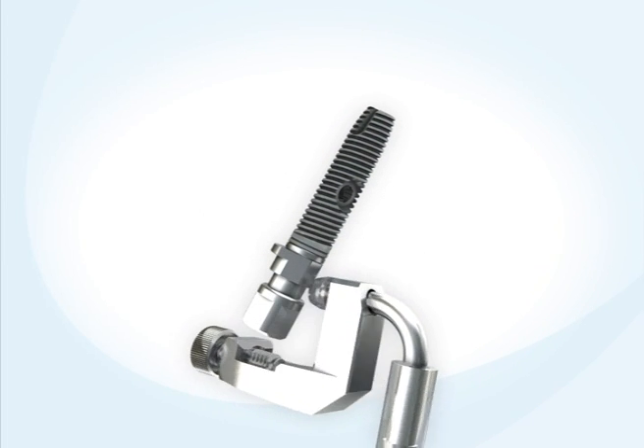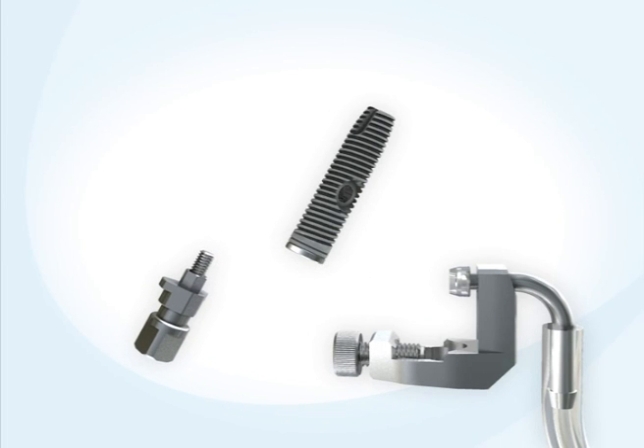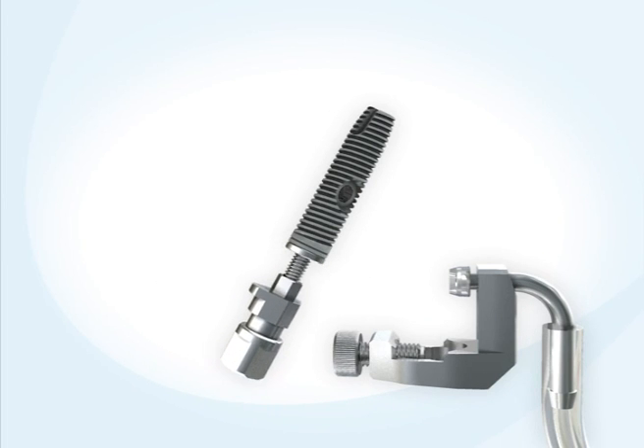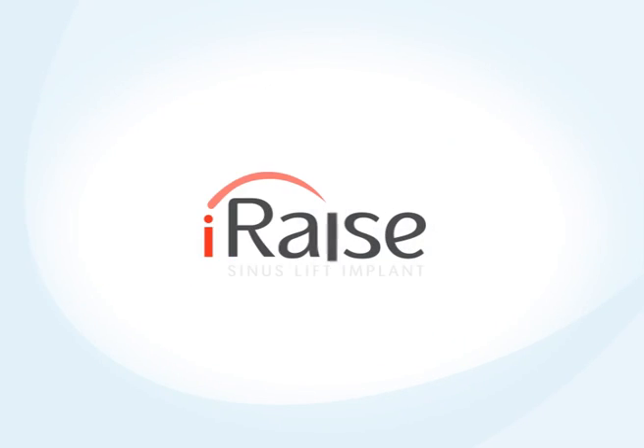The I-RAISE is handled using the implant applicator. An adapter is assembled on the implant to facilitate the injection of fluids.